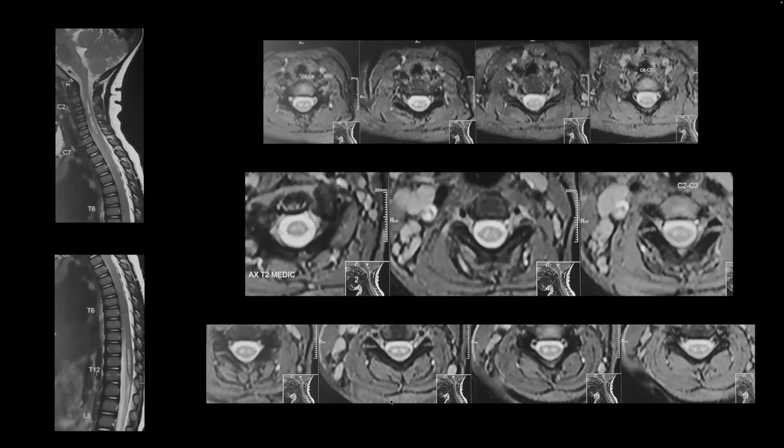These are, I think, again, slightly degraded pixelated images, but non-contrast T2 sequences, you can appreciate some degree of hyperintensity along the cord. It is not swollen, but it's more on the central and ventral aspects in the cervical region and also in the lower thoracic region. On the axial sequences, more centrally and the anterior columns are involved along the cervical segments. I don't have an axial on the lumbar thoracic spine, but these are the axial sections on the cervical spine.